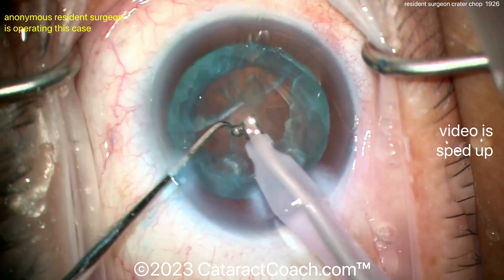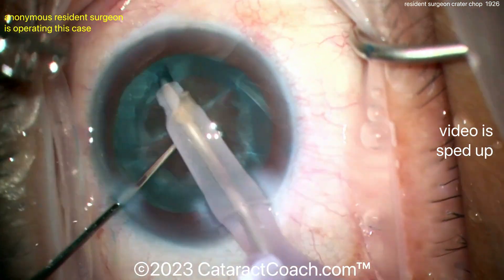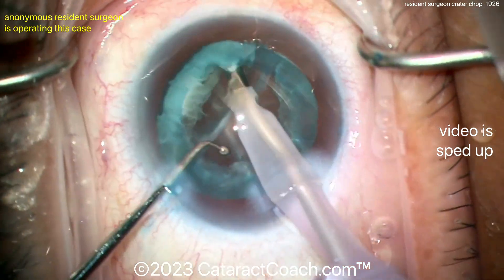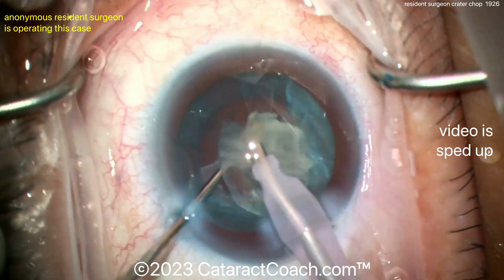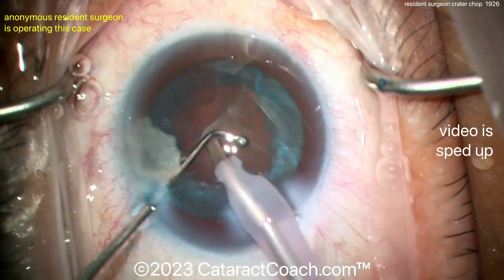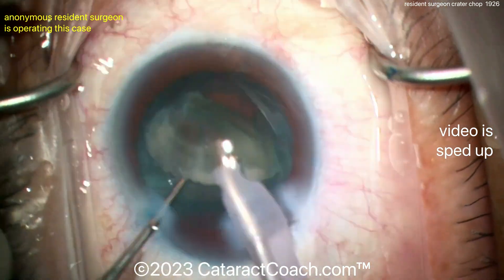The nucleus has been removed and now it looks like just a big epinuclear shell. I bet that can be removed in one swift motion with the phaco probe — there it is. You can see it has some density to it, so the phaco approach is far more efficient here. Very nicely done.